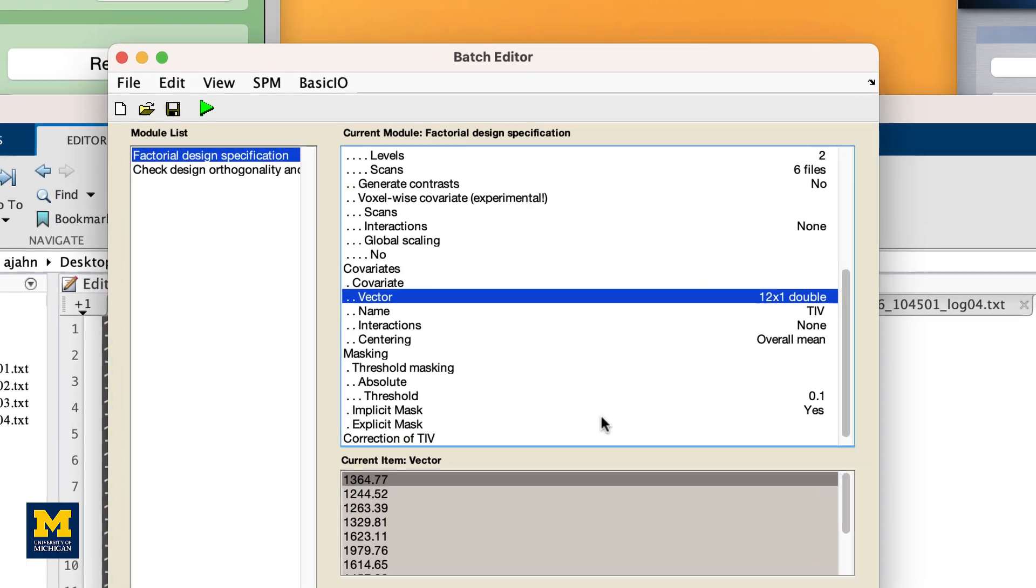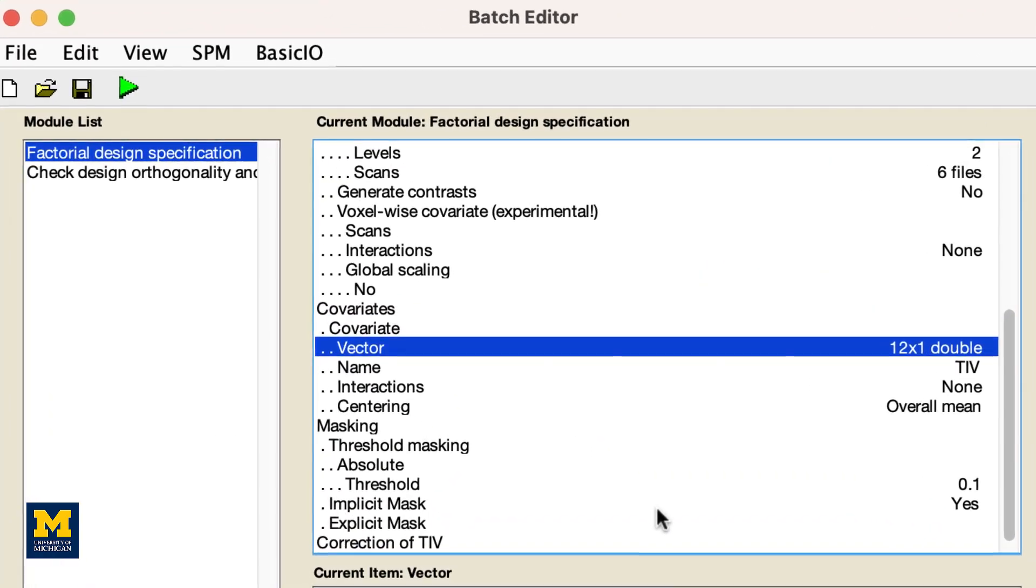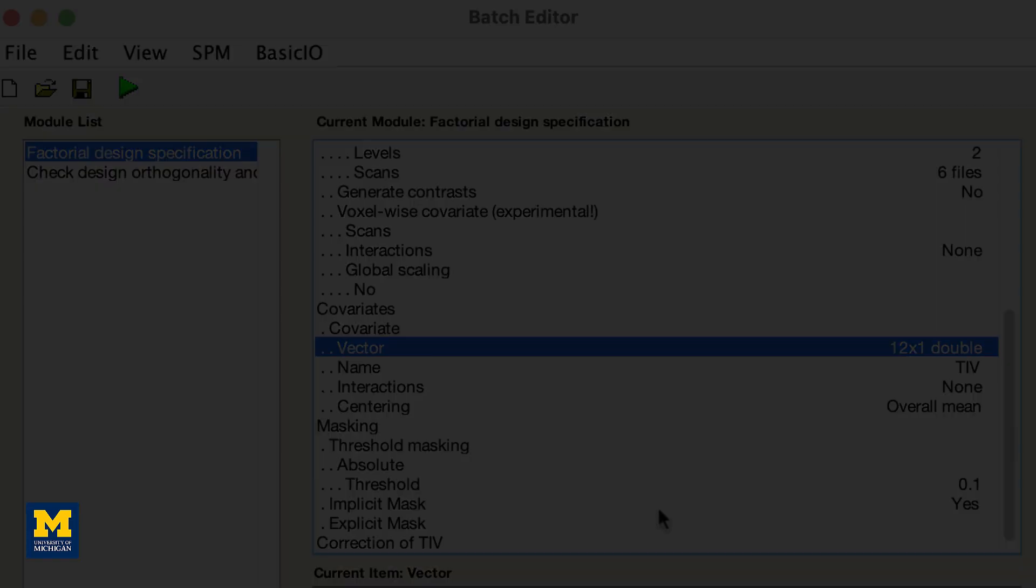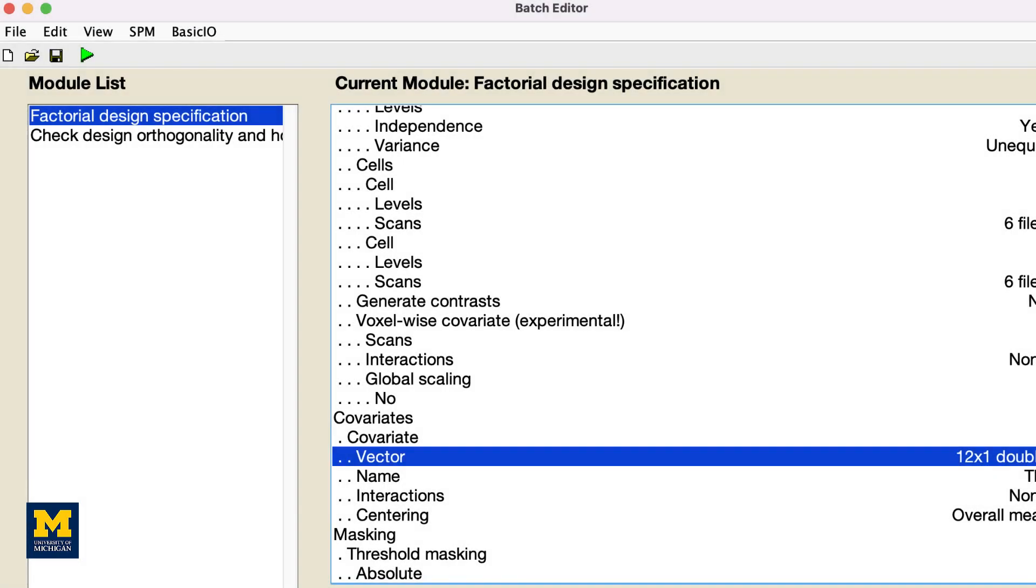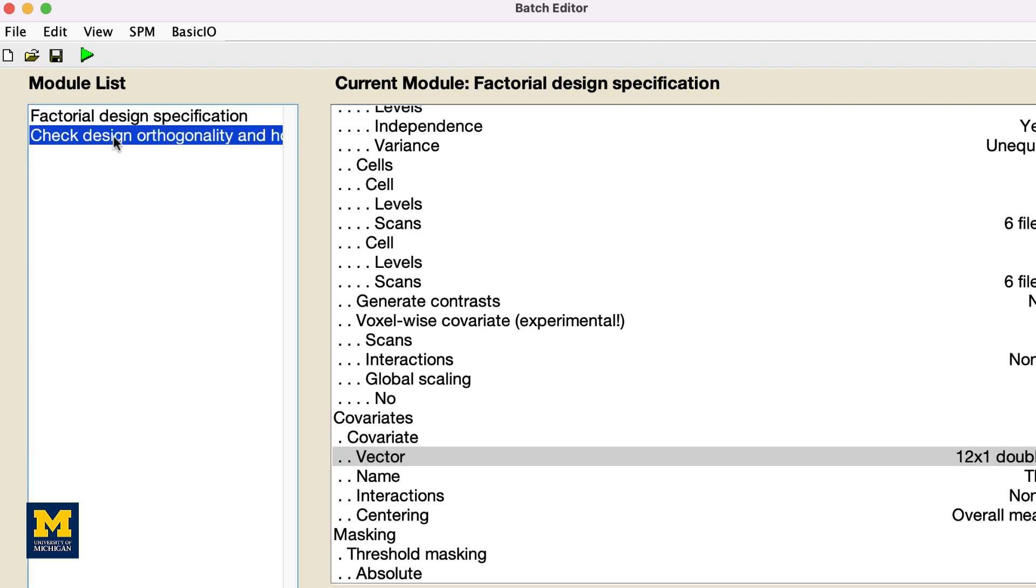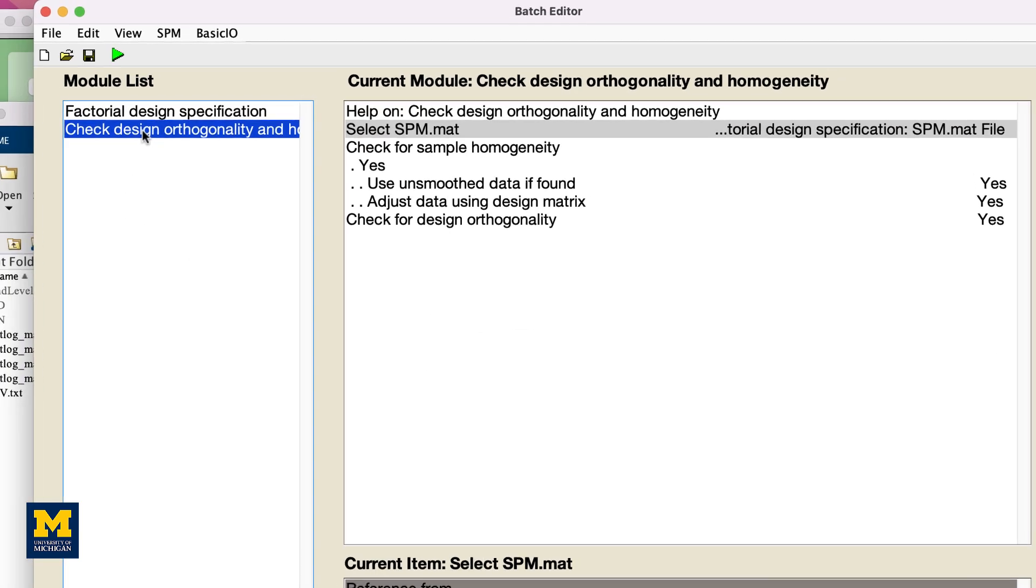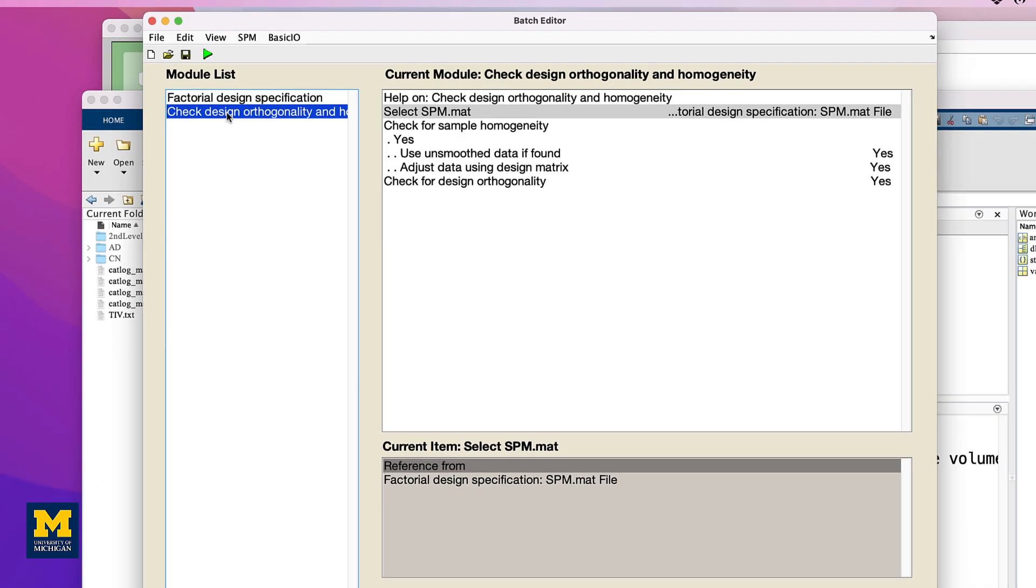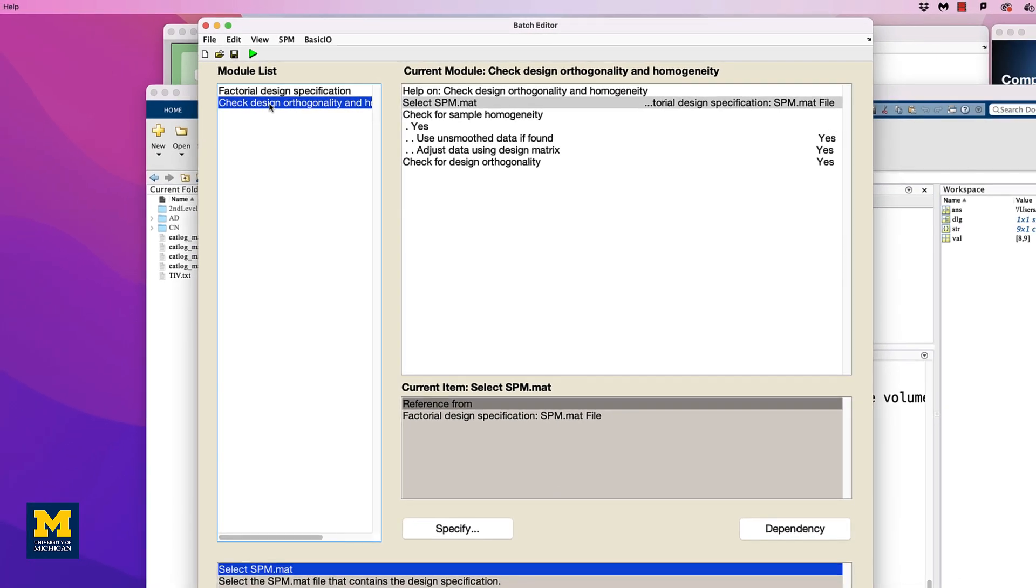When you are done, you should see something like this. When using the Cat12 Basic Models, by default there is another module in the list called Check Design Orthogonality and Homogeneity. This will load the design file you generated in the previous step, and check whether there are high correlations between your covariates and any of the other regressors in your model. Leave these defaults as they are.